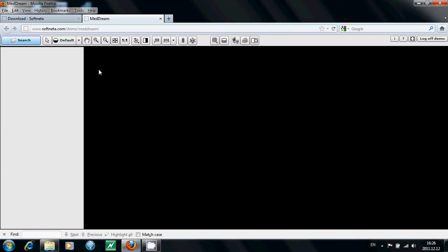Welcome to MedDream. It is a Flash-based web DICOM viewer. In order to work with it, open a study.